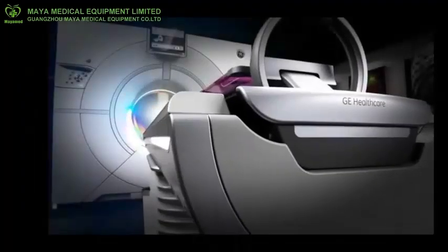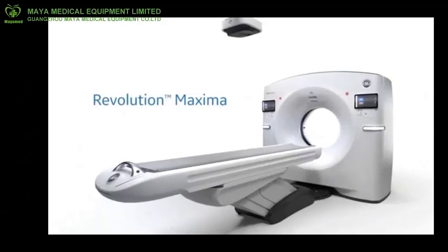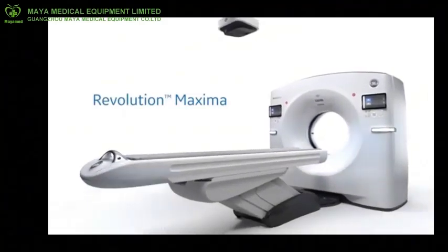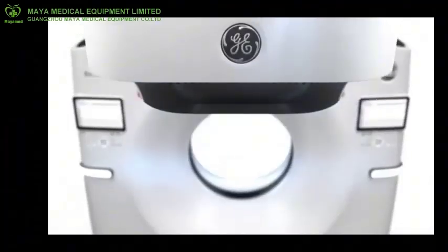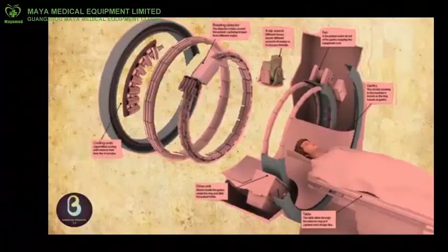Let's learn about components of CT scanners. CT scanners are composed of three important elements: an X-ray tube, a gantry with a ring of X-ray sensitive detectors, and a computer. First, we will look into a gantry. The gantry is the donut-like or ring-shaped part of the CT scanner. It houses many of the components necessary to produce and detect X-rays. These components are mounted on a rotating scan frame.